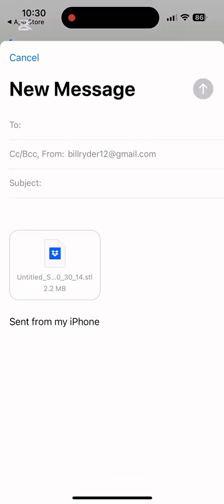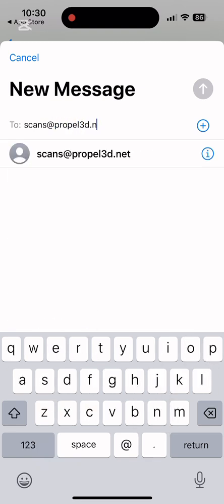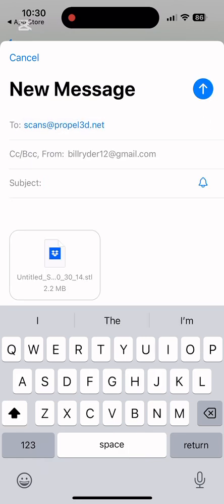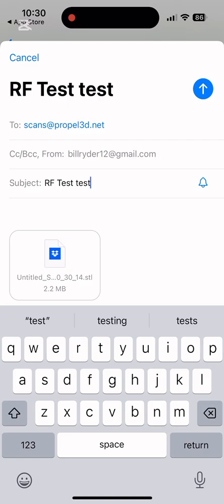Once we save it as an STL, click the right button. You can go through mail, so you either use your mail or your Gmail. Mail's preferential because it'll always allow you to send through the STLs. You just want to make sure that you're logged in on that account. Send that one to scans@propel3d.net, and you can just label it right foot with the patient's name. Once you send that off, you're ready to scan the left foot.